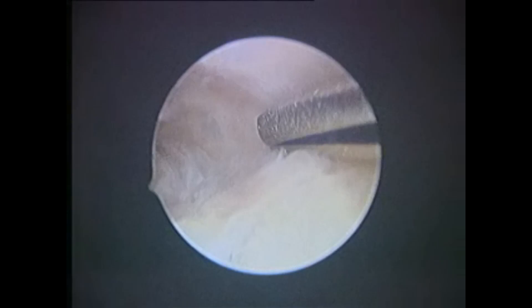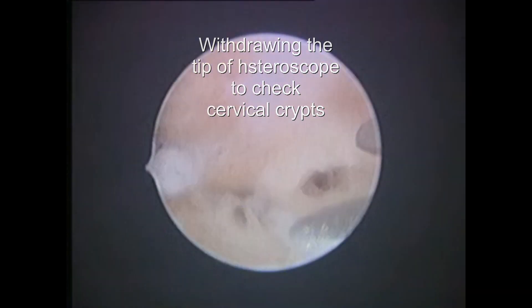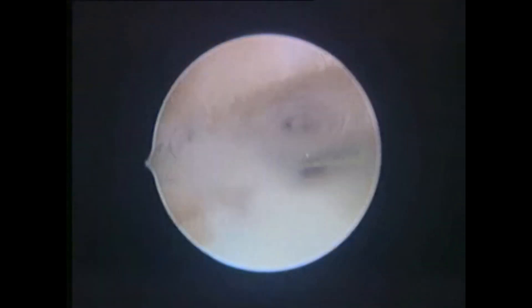We will try to negotiate and enter inside the uterine cavity, but you can see adhesions everywhere — it's extremely difficult. To make sure you are not creating a false passage, withdraw your hysteroscope, see the cervical crypts, and confirm you are not in a false passage but in the cavity part of the cervical canal. This is how you withdraw, and you have to verify before proceeding. This is how you go on cutting on the left lateral wall with the scissors.